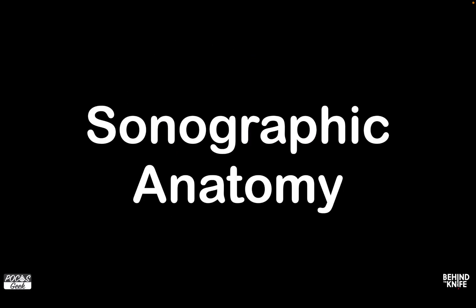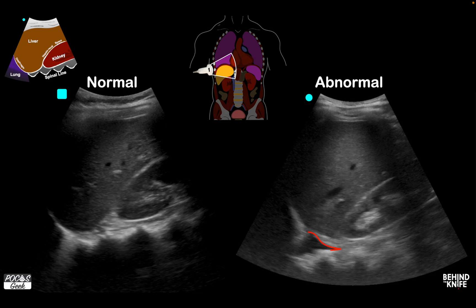Now we're going to talk about where we see these things on sonographic anatomy. On the left side of the screen we'll have normal on each one, and on the right, abnormal. As we go through each pathology, they'll each be circled in red. Looking at the pictogram, we can identify the liver, the hepatorenal space, and the kidney. We also have the spine line, which disappears into the diaphragm. On the abnormal side, the spine line continues past the diaphragm — this is the spine line sign, and it indicates pathology in the thorax. In this case, it's a small amount of hemothorax, and although small, this can indicate an area that needs to be watched.